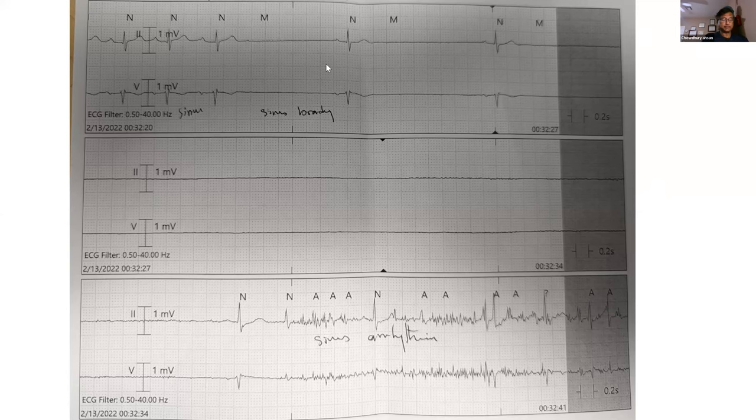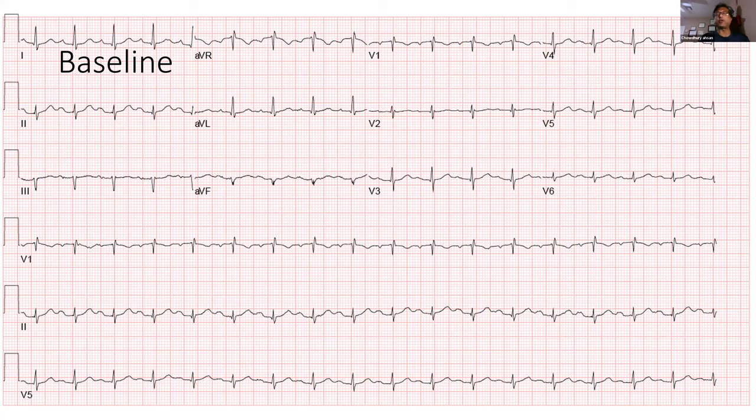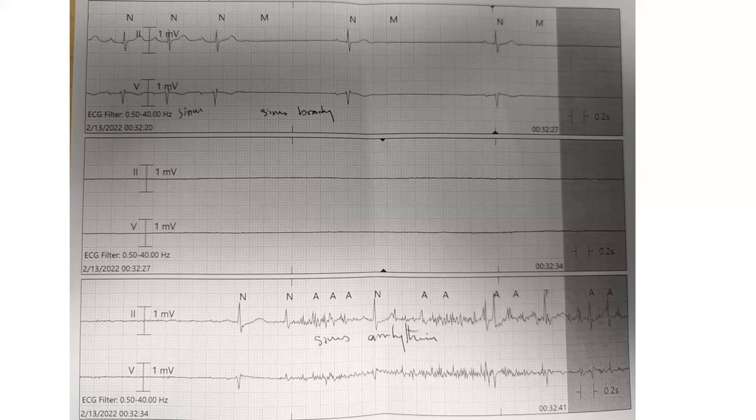Any comment? Did the patient pass out? I was looking for the timing, Rafique bhai. If you look carefully, this is 13th of February at 12:32 a.m., at midnight, so he was sleeping. What is the body weight? Body weight, I don't know, but I did see the patient. A little bit on the obese side, but not grossly obese. Sure. Any comment on the telestrip? Anybody? Yeah, Junior.